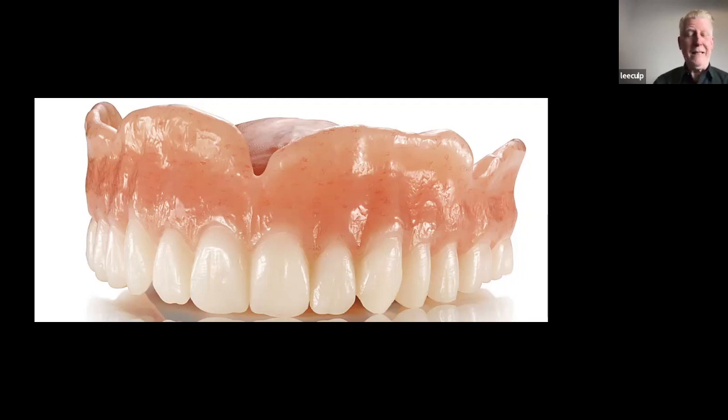I just didn't agree with it, because you had to take things out of the mill, and you had to put things back in the mill. So we did the proper Ivoclar technique one time. And then we figured out how to change the settings on the files, where we could mill the denture complete to finish, and we could mill the teeth complete to finish, and then we would bond them together. And I'll show you why. But that's what you're looking at here.